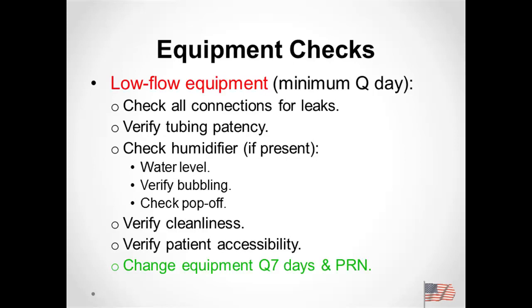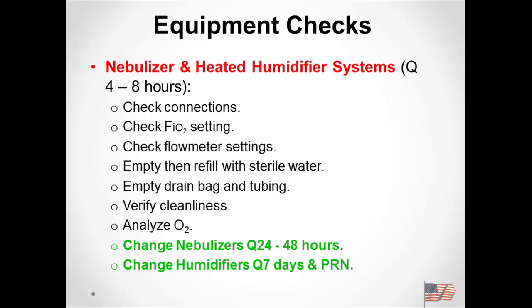We know about low flow equipment. We want to verify that if they're using a humidifier, the water level is appropriate and the pop-off is working. And we typically clean those once a week if they're not already discharged. By that point in time, most patients are out of the hospital. Anything wet, we're going to change daily. I think I mentioned that before.